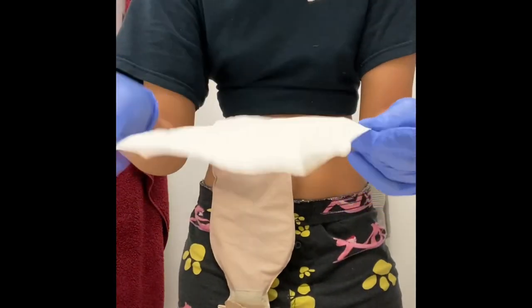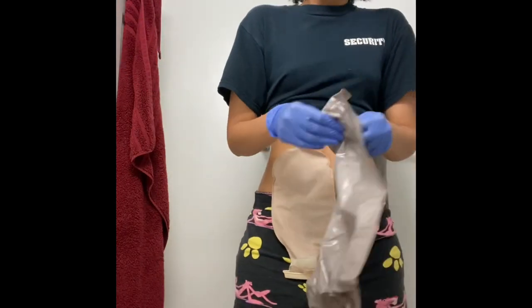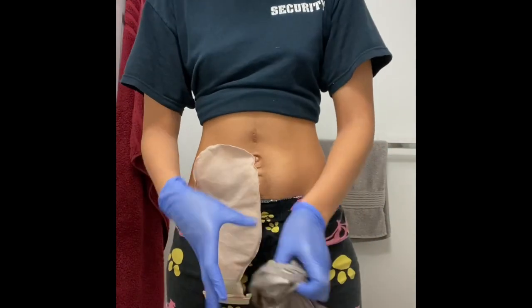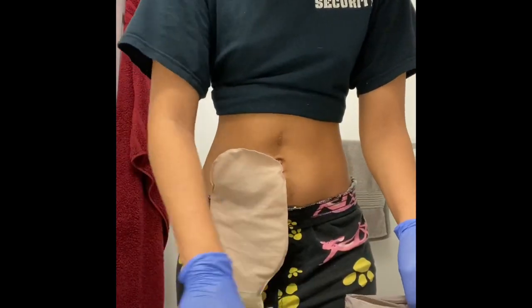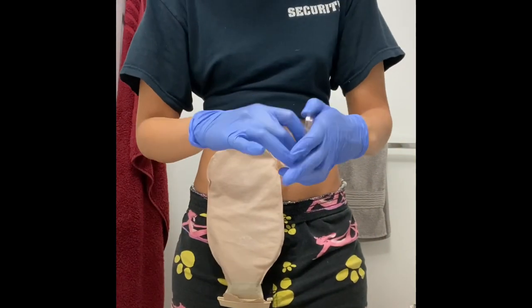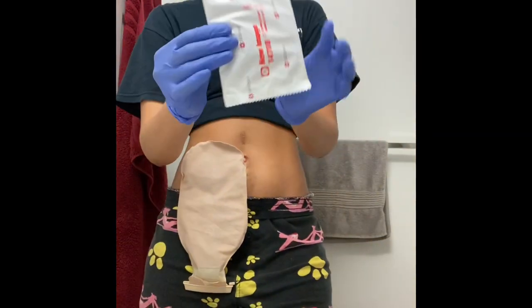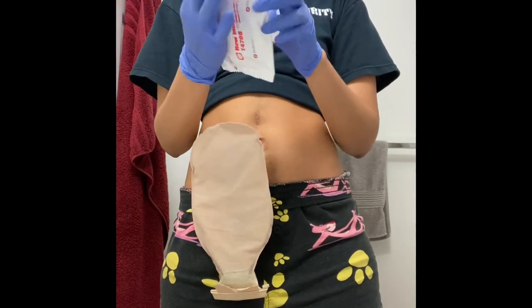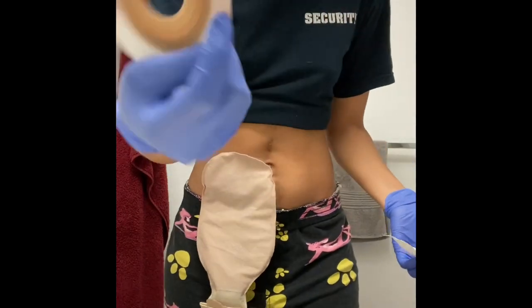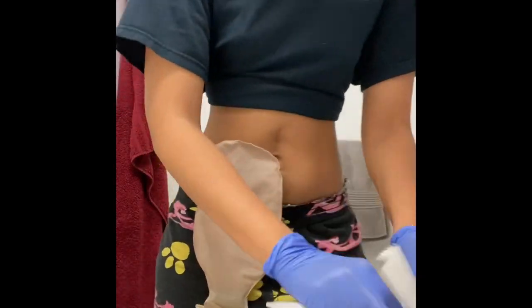I am going to get my stoma cleaning station together with my paper towel squares, set up my garbage, and pre-open my barrier ring and get the packaging off. You'll see that I didn't need the scissors because my flange is already pre-cut to the 35mm that I need it to be.